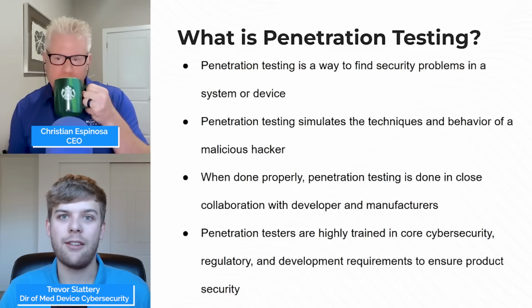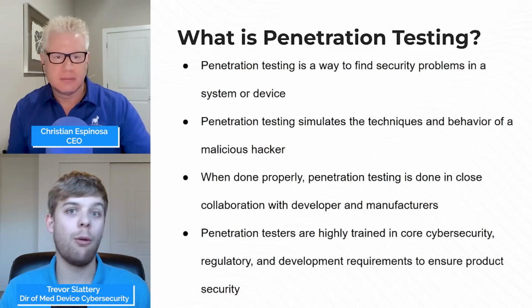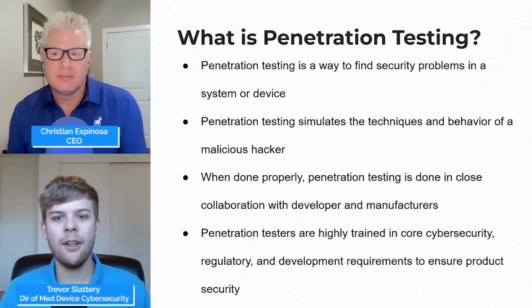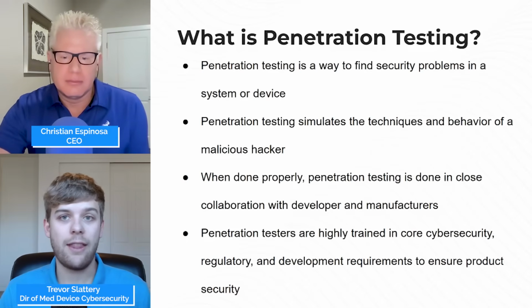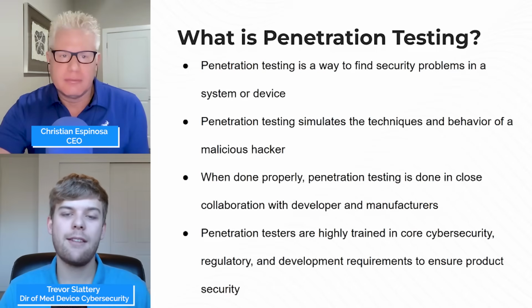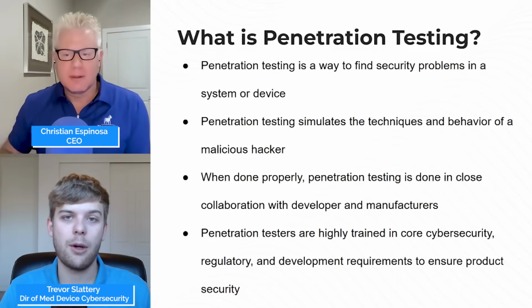That's why the FDA wants to enforce this for new medical devices. This way, once they're fielded, all the vulnerabilities are hopefully shored up and attackers aren't going to be able to find a way in. Penetration testers are highly trained in core traditional cybersecurity concepts. With the FDA focus in mind, of course, they have to be very focused on regulatory requirements and development to make sure that they know what they're doing and how to fix it. It's one thing to know how to break a system, and it's another thing to know how to remediate a system once you have broken it.